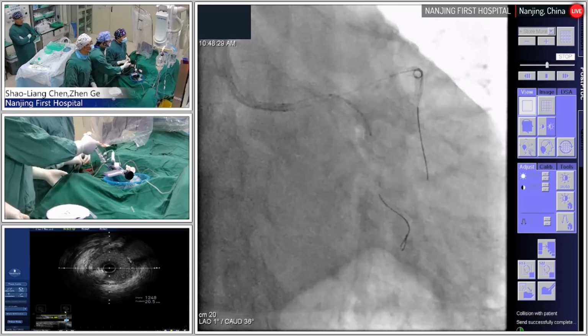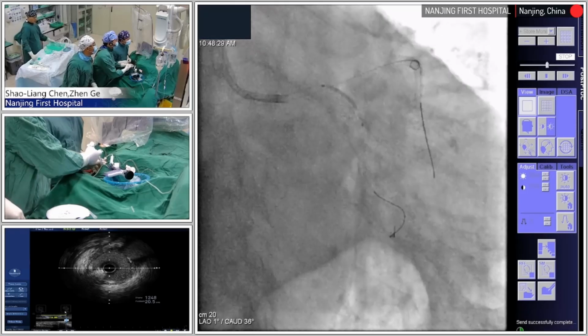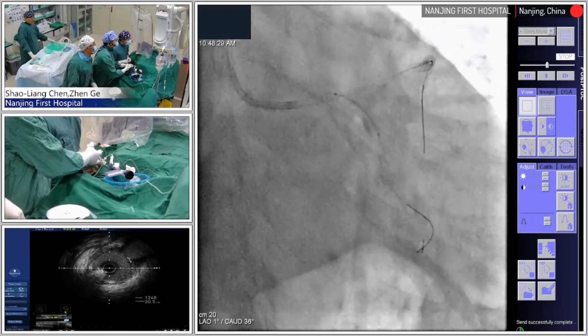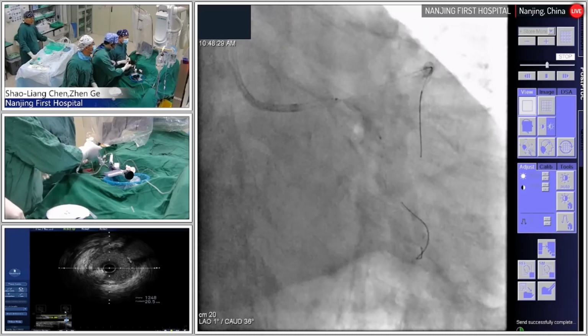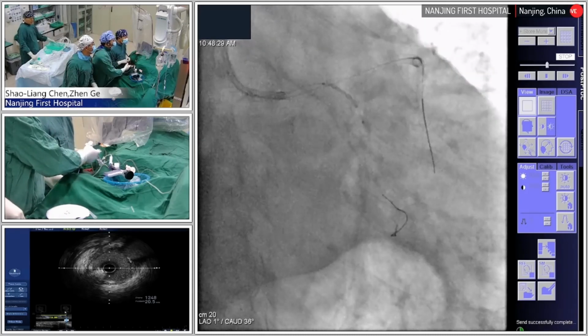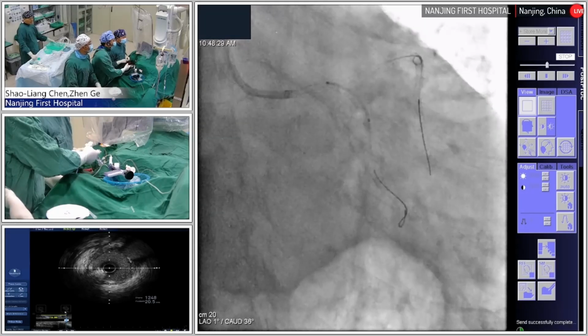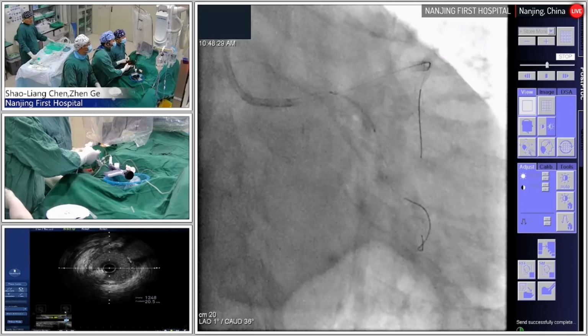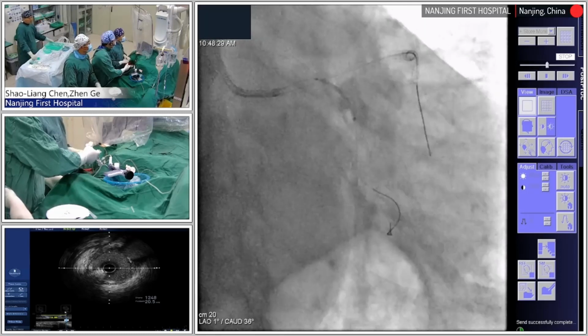This is because they change of calcified plaque after modification. So for some cases, if the vessel lumen is big enough, usually we don't treat the proximal calcified lesion at first. I think you can pull the wire more distally. Oh, you did draw. Oh.